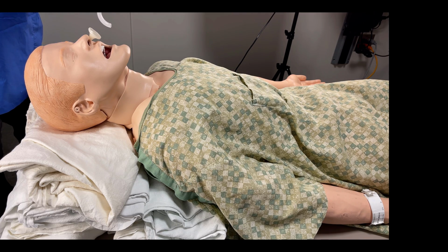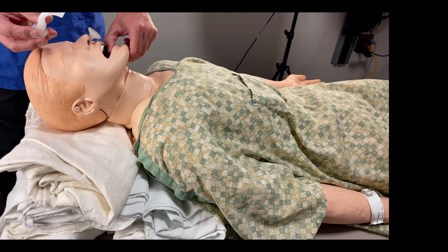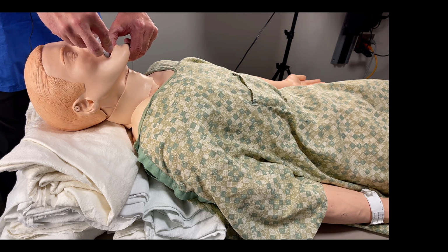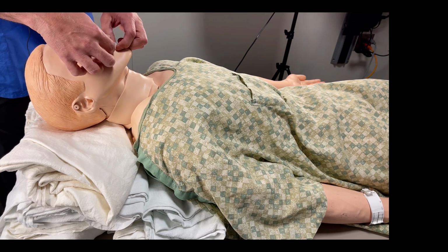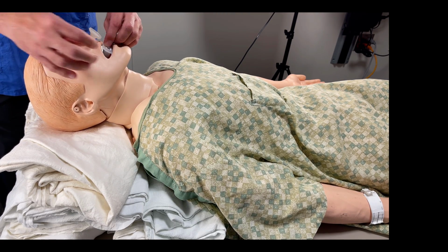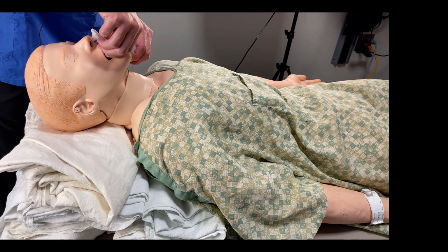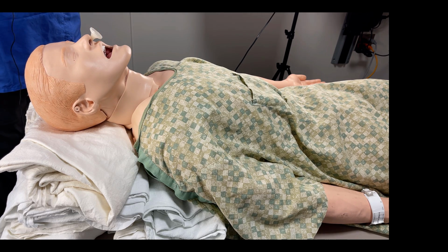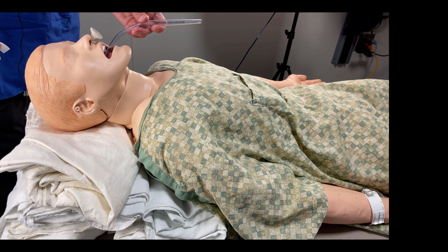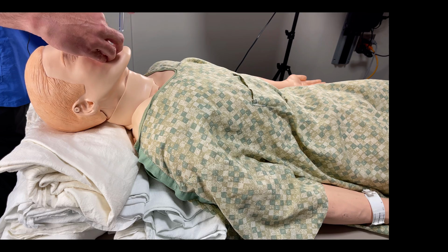Now there are a couple of techniques we talked about for OPA placement. One is without any airway adjunct, and the patient is unconscious, we can insert this device backwards. What we do is insert it, and once we get around the tongue, we rotate it 180 degrees to sit on the teeth here. Now, that's one technique. Another technique I really like is the use of either a tongue blade, or I've even used my suction catheter before. Without having to turn it at all, I can just softly displace the tongue, and that really facilitates sliding in my oropharyngeal airway.